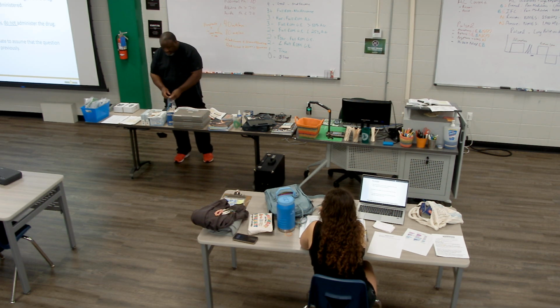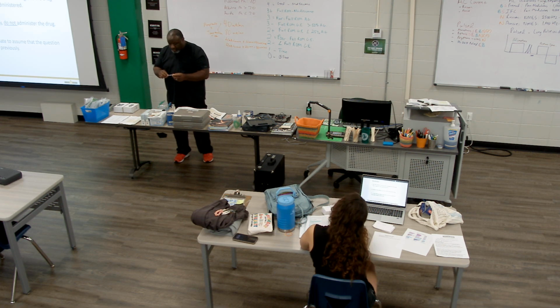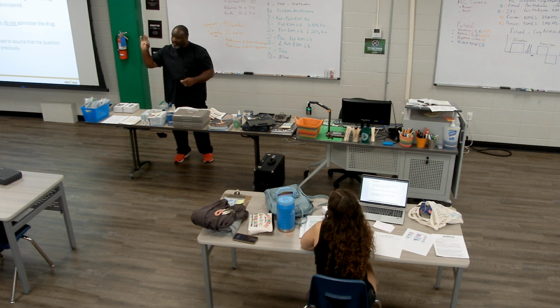So this is a simulation of the drug. Your drug will come in something that looks like this, like a drug medication bottle. This is just saline water, so don't worry. They will have needles there, either needles that you screw on a point like this, or needles that click onto the bottle. It really just depends.